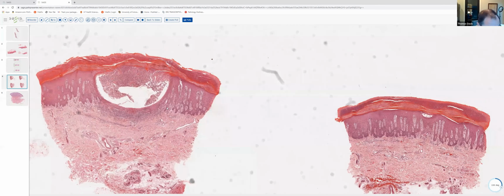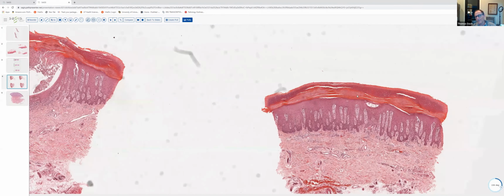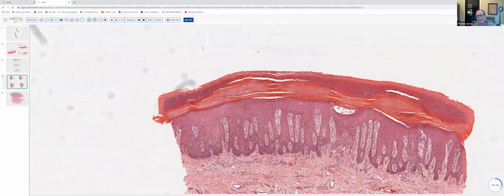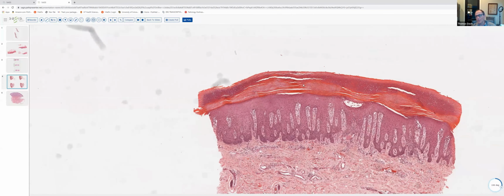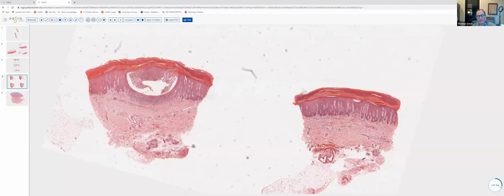Now, obviously, in this instance, especially with the pustular dermatitis on a volar surface, one would need to check a PAS to make sure that this wasn't an inflammatory dermatophyte infection. Usually, inflammatory dermatophyte infections don't so closely mimic psoriasis, but you'll always want to carefully scrutinize the cornified layer, looking for the presence of hyphal elements either in the H&E stained sections and/or get a PAS or GMS stain to rule out the possibility of dermatophytosis in a biopsy like this.